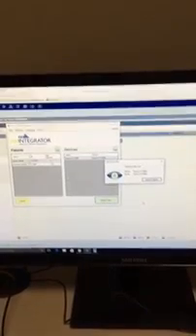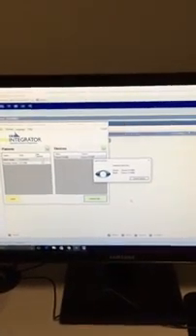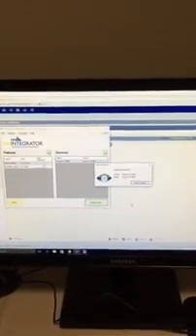Okay, and it takes a few seconds for everything to go through. And when the data comes through, you will see this window pop up. And basically this is all the information from the Phoropter that has transferred into Revolution. So you want to hit this little button here, send to Revolution EHR, and then hit OK. And then I'm going to go back to the encounter.